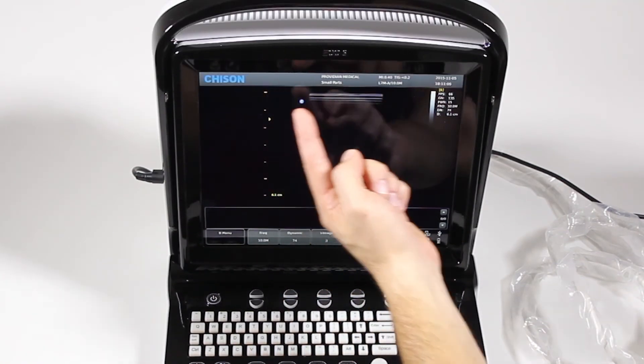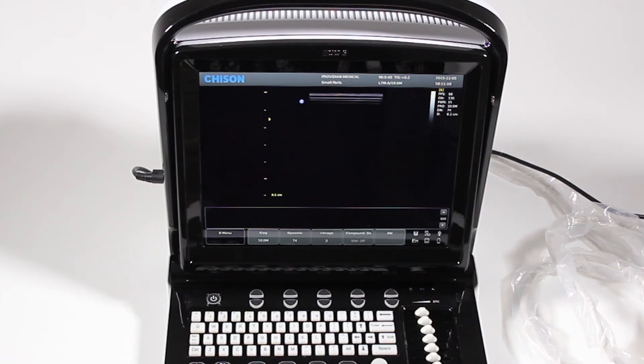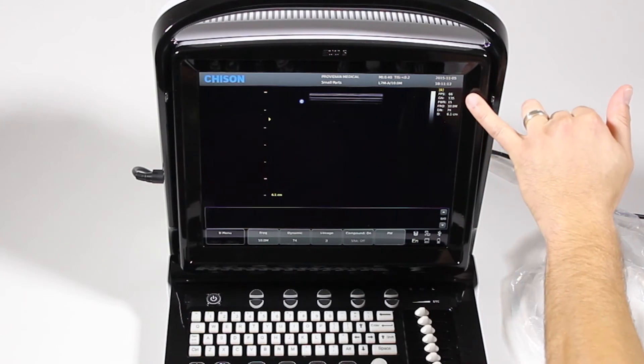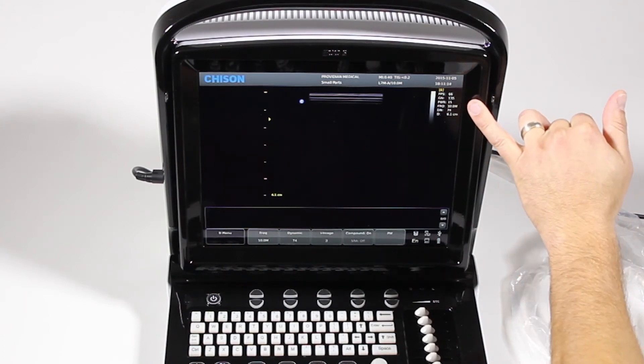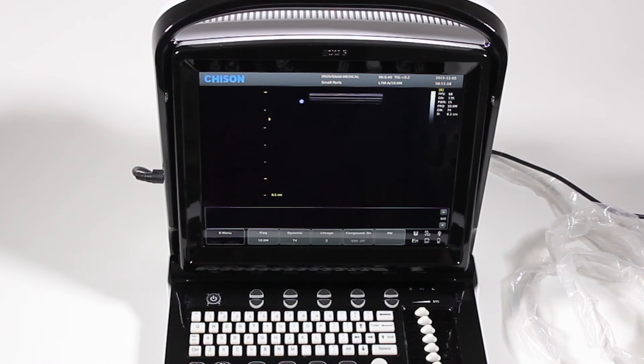Along the top, we just have general information about the facility, the probe, your indices, your date, your time, and then information along here tells you about the frames per second, the gain, your power, frequency, your dynamic range, and your depth.